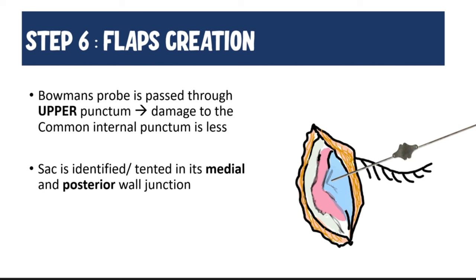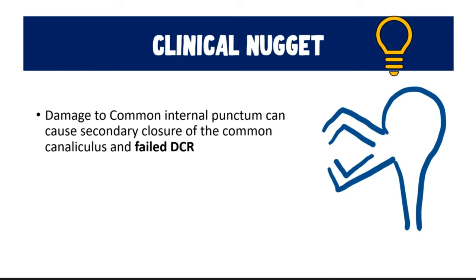The sixth step is identifying the sac to create flaps within it. A Bowman's probe is passed through the upper punctum — this results in less damage to the common internal punctum. As the probe is inserted, the sac is identified at the junction of its posterior and medial border, a process called tenting of the sac. It is very important not to damage the common internal punctum, which is why the Bowman's probe is inserted through the upper and not the lower punctum. Damage to this opening into the common canaliculus can cause secondary closure, leading to a failed DCR.